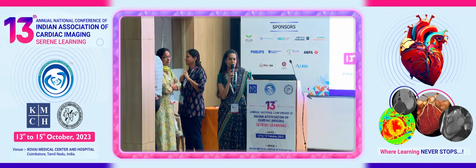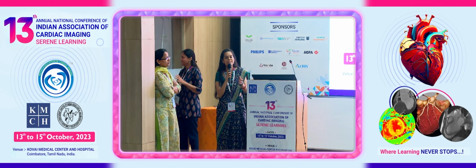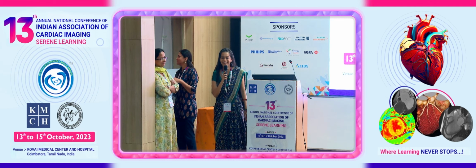We use the injector and we get beautiful images. By the time they wake up, the scan is done, probably.